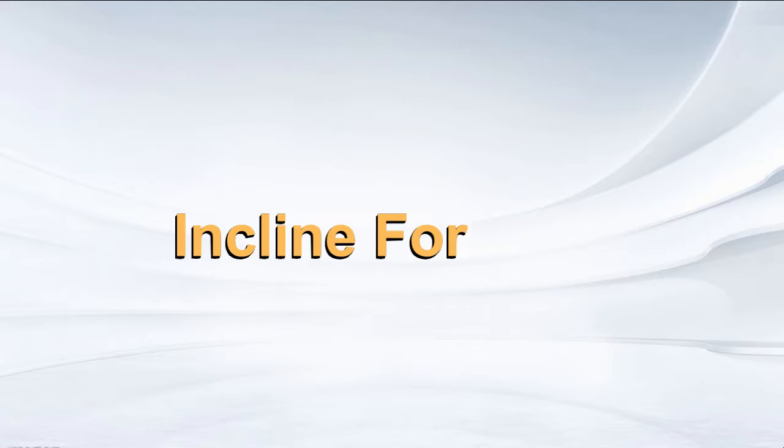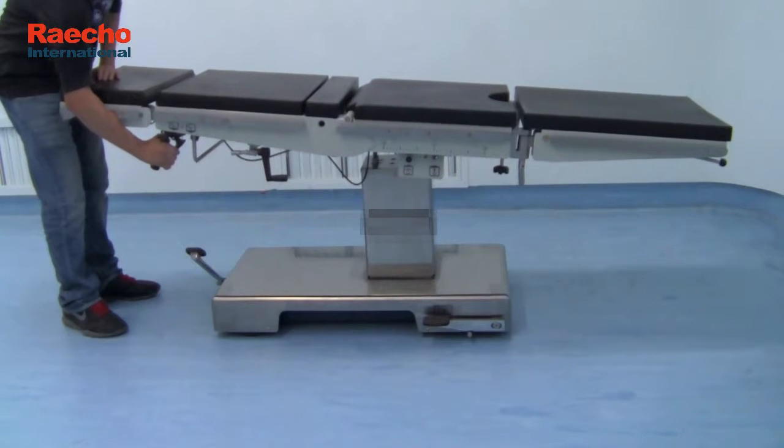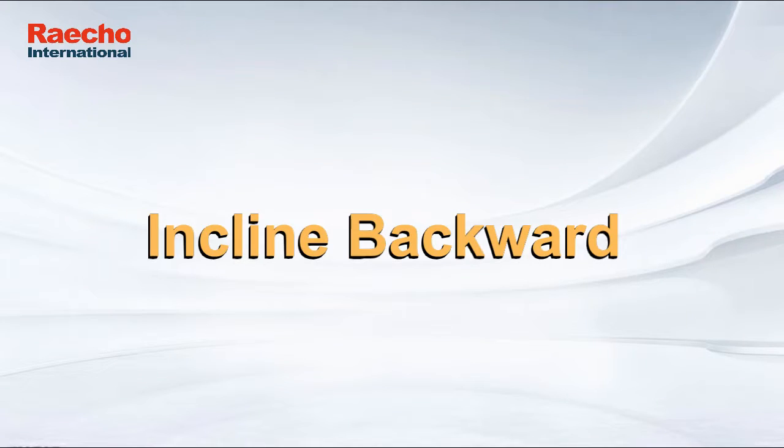Inclined Forward. Front-Back-Incline Switch. Inclined Backward.